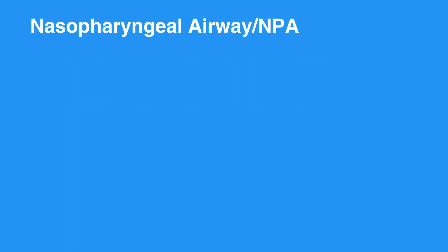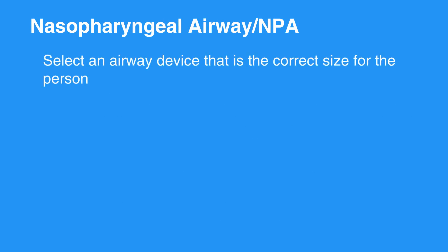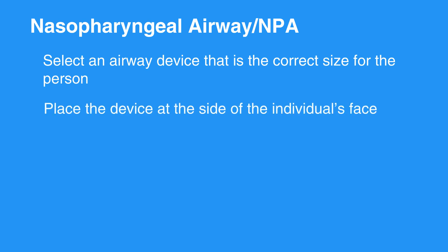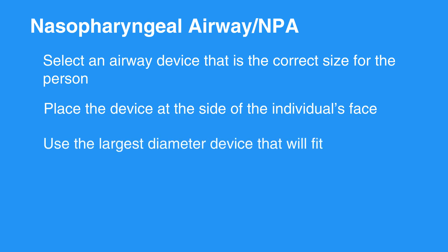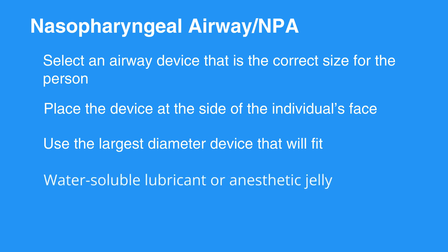To insert a nasopharyngeal airway, or NPA, select an airway device that is the correct size for the person. Place the device at the side of the individual's face. Make sure to choose a device that extends from the tip of the nose to the earlobe. Use the largest diameter device that will fit.